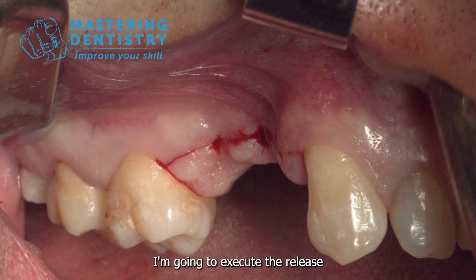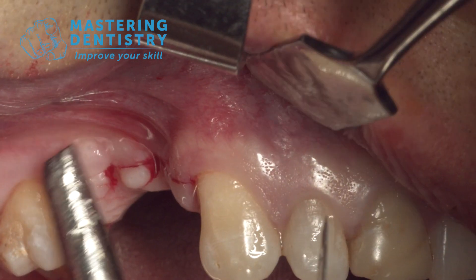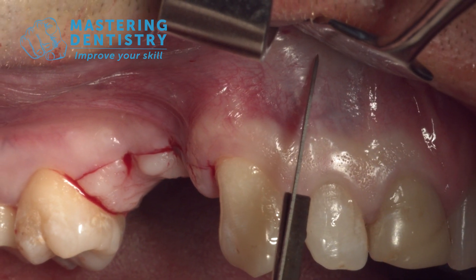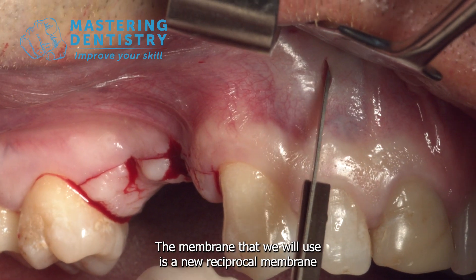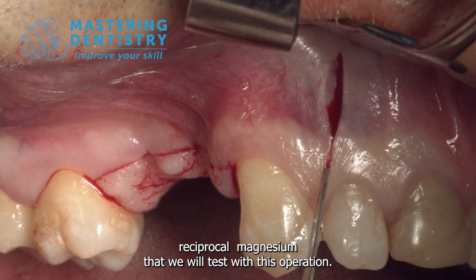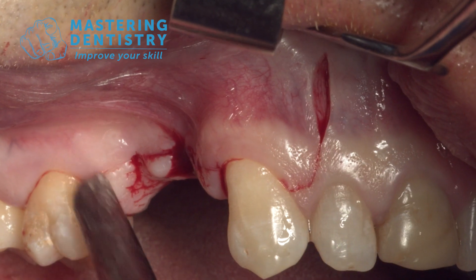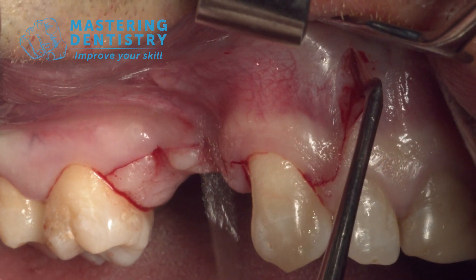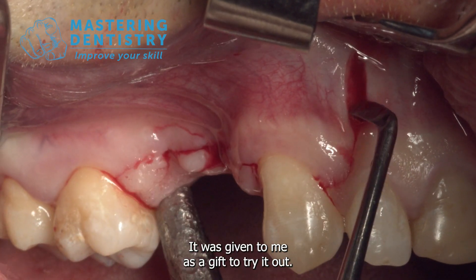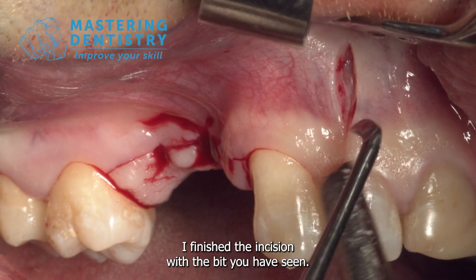I'm going to execute the release incision here. The membrane we will use is a new resorbable magnesium membrane that we will test with this operation. It was given to me as a gift to try out, and I'll show you how it goes. I finished the incision with the bit you have seen.